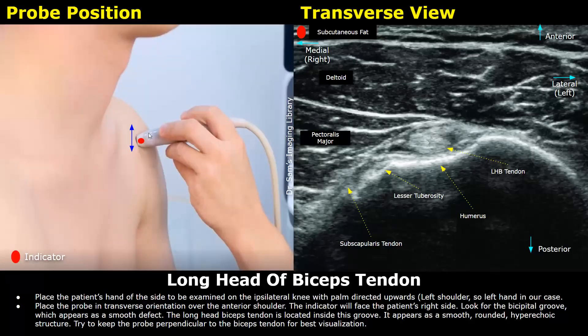In this image we can see the probe placement — it is placed in transverse plane over the anterior shoulder. Above the biceps tendon is the deltoid muscle, which will be hypoechoic compared to the biceps tendon. In the transverse plane, the indicator is directed towards the patient's right side, displayed at the top left of the image. The medial side is towards the patient's right and the lateral side is towards the patient's left. The anterior portion is at the top of the image — that is why we see the skin and subcutaneous tissue at the top.